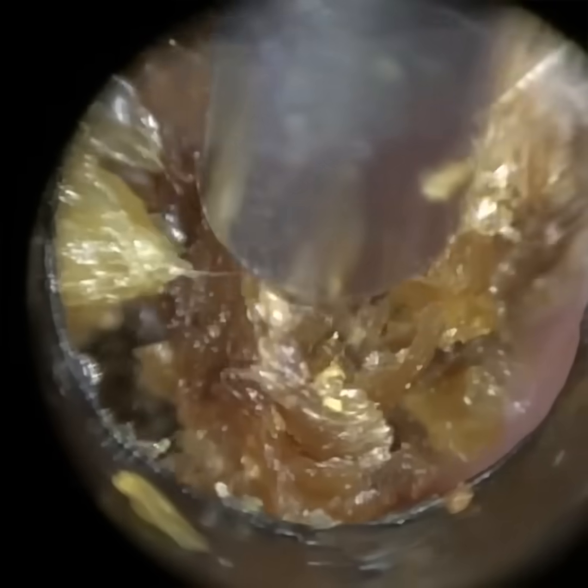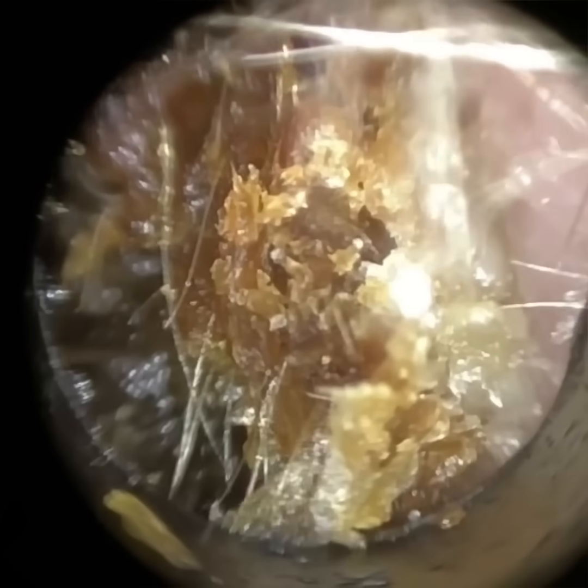So instead, your brain is just receiving the view from one eye, and you get monocular vision. And a lot of people actually struggle to develop the binocular vision, because at first you almost see double vision. You're seeing both sides from both eyes, and they're not converged, and you have to train your brain to converge these images you're receiving from both eyes into one single image. And so it does take a bit of practice. Even with an ENT microscope though, if you've got very deep wax and a very narrow ear canal, it's still not possible to see that, even with the artificial converging of the pupils.